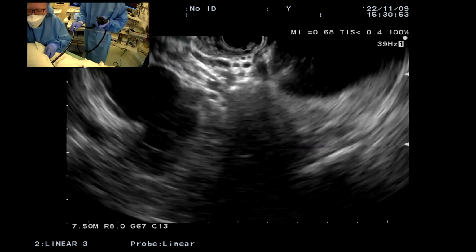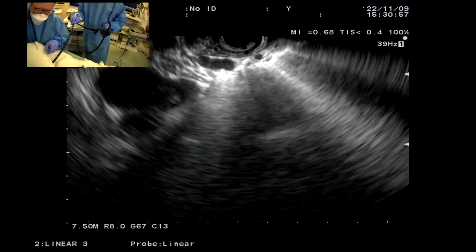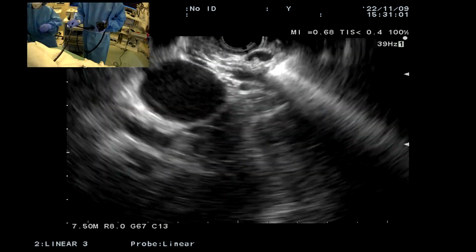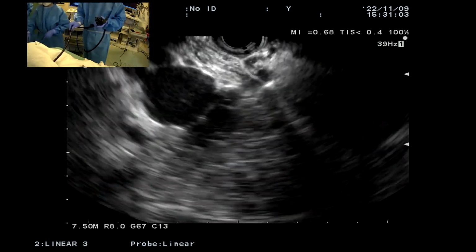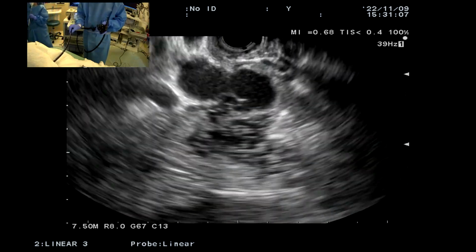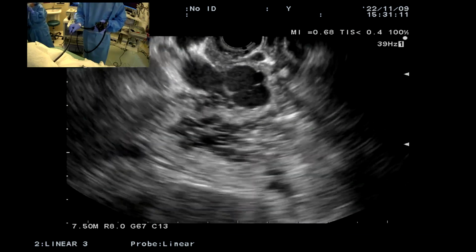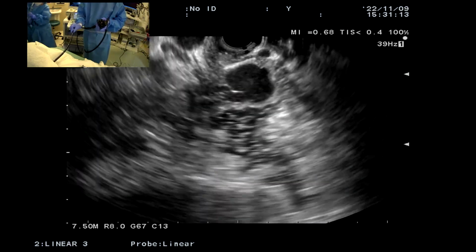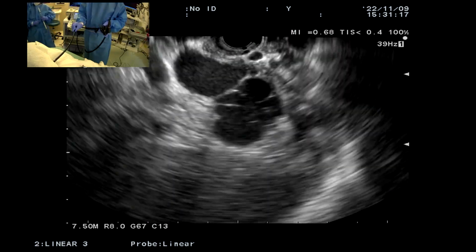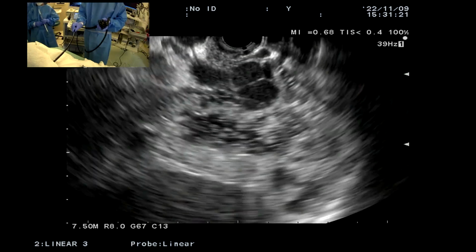So these esophageal varices are usually drained to the azygos vein. The fundic varices drain to the IVC through the gastrorenal shunts. And just now I'm using the distal esophagus as a window to look at the fundal varices. So you see the fundus below, right? And there's that big varix coiled up, sandwiched in between. So I'm in the distal esophagus.